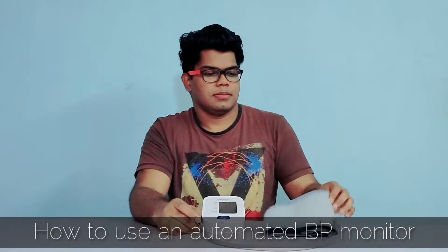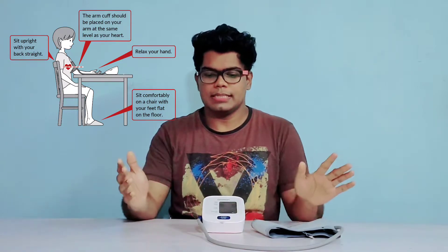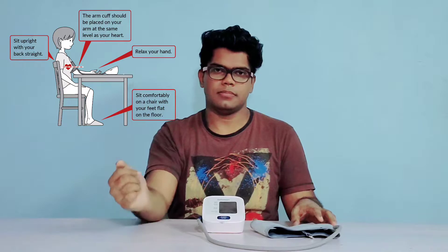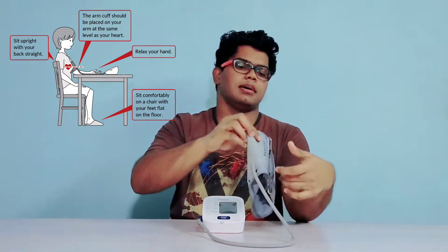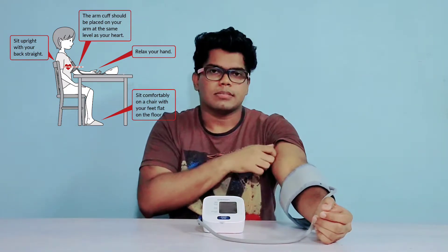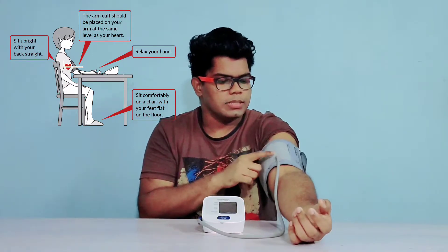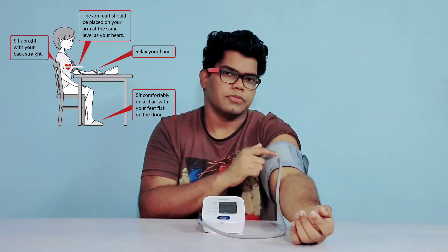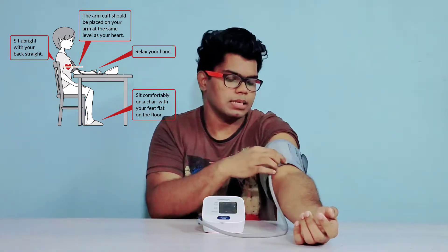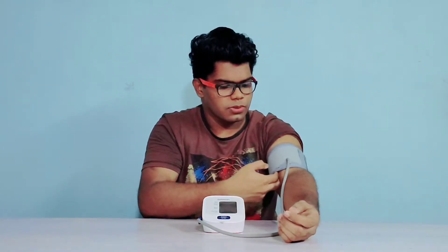How to use it: Make sure you are sitting in a comfortable position and do not cross your legs. Keep sitting in a relaxed position and keep your hand on a table and wear the arm cuff. Avoid clothing as possible because clothing may interfere with accurate readings. Make sure you keep the tube side on the underside of your arm — there is also a marking given. An arrow and an artery marking are given, and you should wear it accordingly. Don't tighten it too much or keep it too loose — it should be loose enough to fit two fingers.